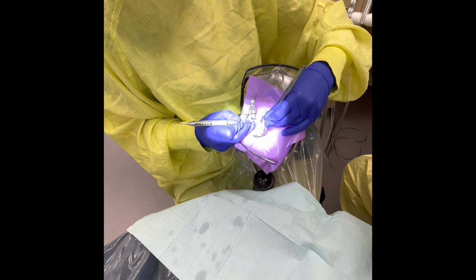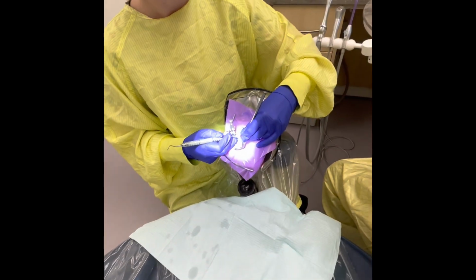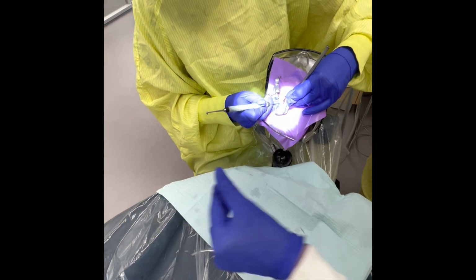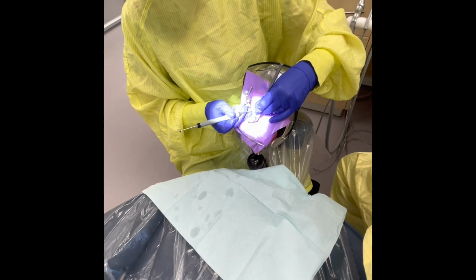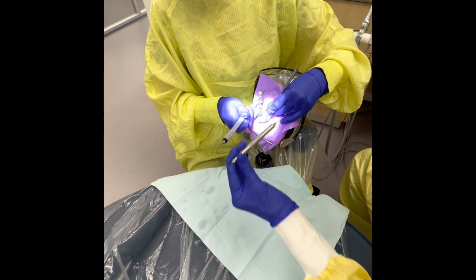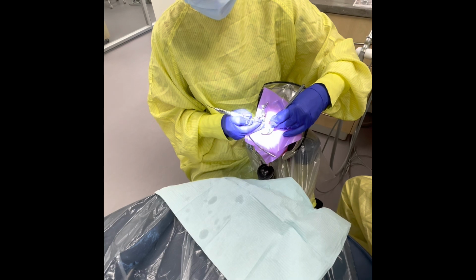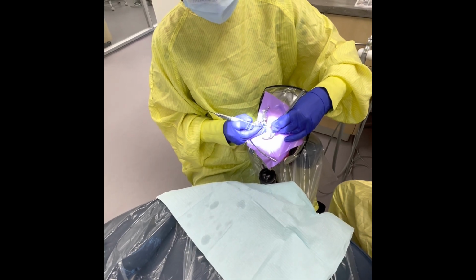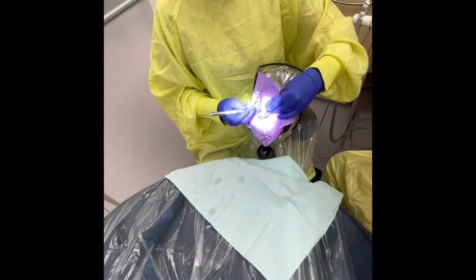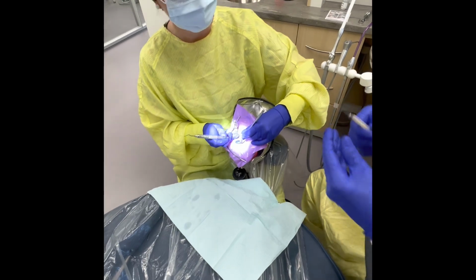Okay. So what I'm going to do next is go right to my next instrument in my sequencing, and that will be my ball burnisher. So I'm going to come in there. Amanda's going to smooth out that amalgam. What will be next in the sequencing is an explorer. And the explorer is used to remove any excess material from the band so that it's easier to remove. And what carver would you like, Amanda? I would take the disc end of the discoid cleoid, please. So here's our disc end.